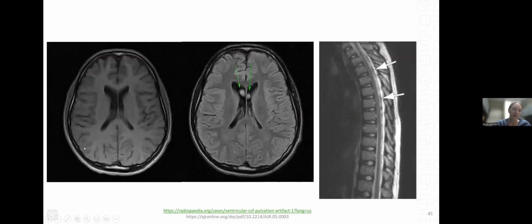Here on the left-hand side, we have our T1 image. You're looking inside the ventricle system. Looks fine, it's black, you don't see anything. But how come on this FLAIR image, now you're seeing these hyperintensities, and you may be concerned that that's pathology, but really that's just CSF motion artifact. So that would be important to correlate with your T1 image, knowing that you can have this artifact specifically on your FLAIR images, and correlating to know what you're looking at, that is not pathology.